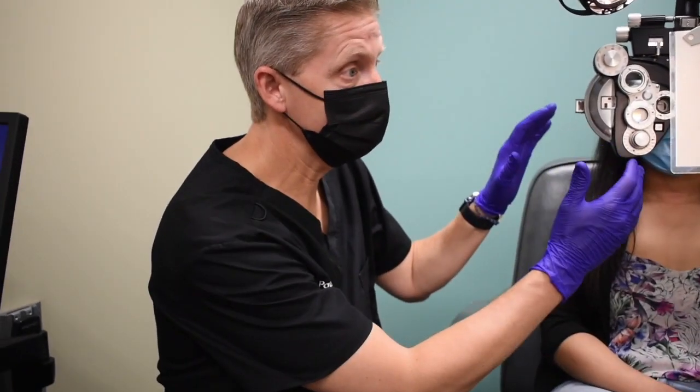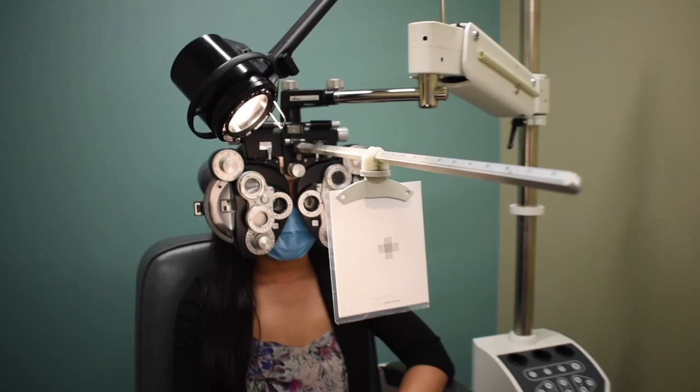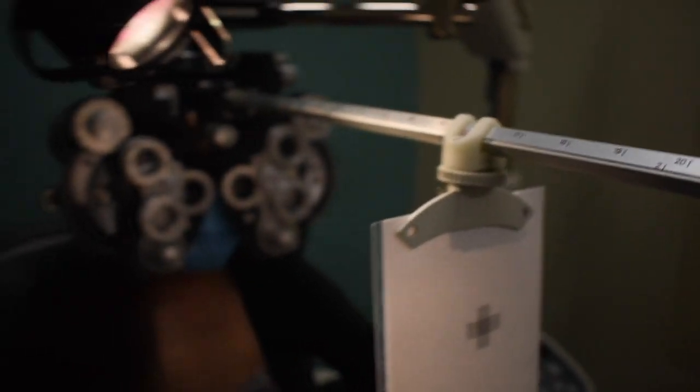We have our patient set up, room lights are normal, reading light is on, and we've verified the card is at 40 centimeters. For all near point tests, we want to go from a relaxation test to a stimulating test. We do the plus lenses first — that's our NRA — and then the positive relative accommodation or PRA with minus lenses second, because we don't want to trigger accommodation before we've relaxed it.